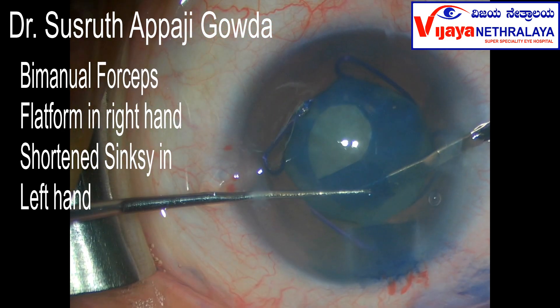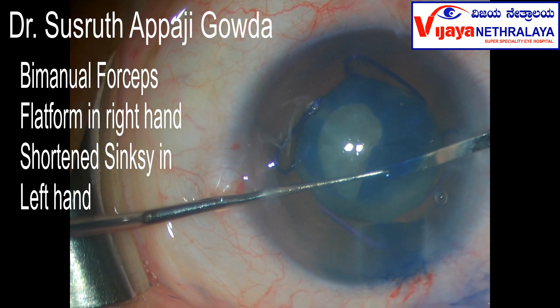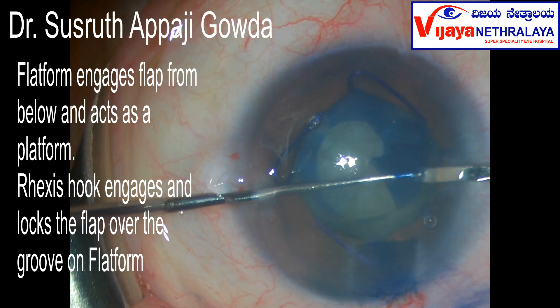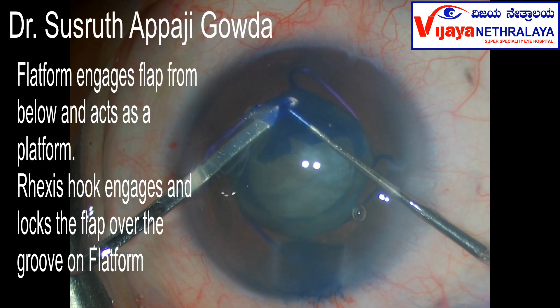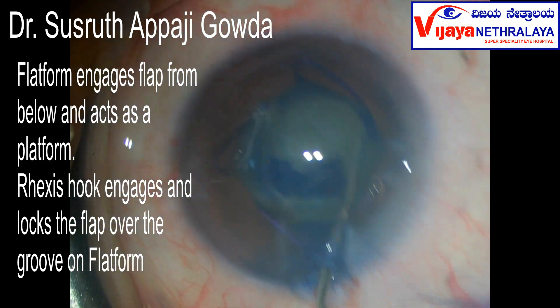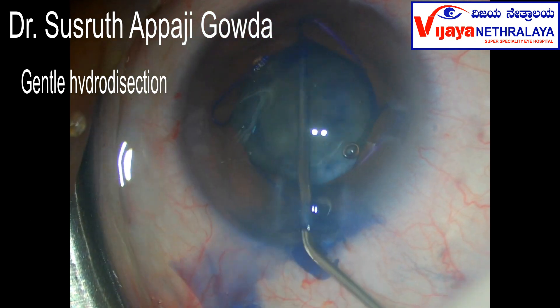The capsule is caught close to the shearing edge and pulled for desired shearing. This technique was invented by my father, Dr. Appaji Goda, even before people had heard of micro forceps, Fugoplasma blade, Cloticapsulotomy, Zepto, or Femtosecond Capsulorhexis. Our instruments are very economical and sturdy and can last a lifetime. You don't have to pay AMCs or handle them delicately like micro-rhexis forceps. We didn't even think of patents — we wanted everyone to use this freely in their practice. Anyone can get these instruments made; they are very simple to make and can last a lifetime.